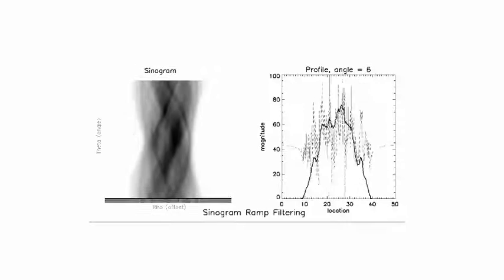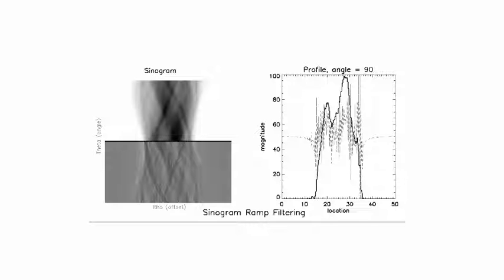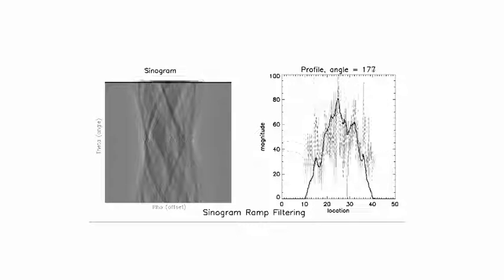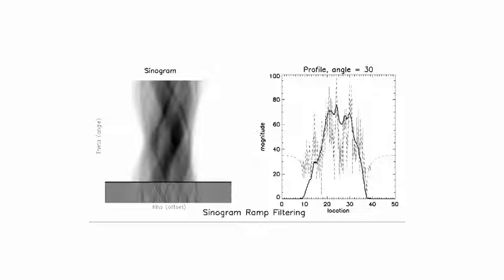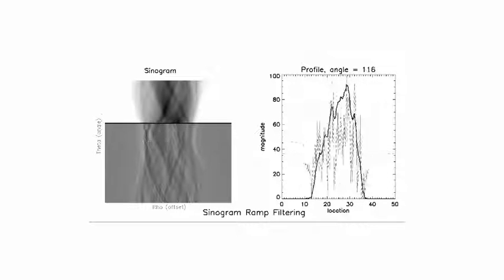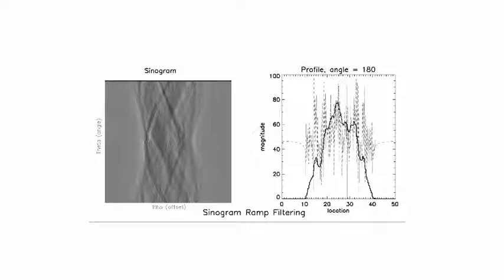In the inverse Radon transform, the beams pass parallel one to another. I mean, it's a straight beam. It does not deviate or form a triangle shape. That's the fan way. The beams are all directed to a single target, in a triangle or fan shape. The inverse Radon transform is a little more efficient, and CT of latest generations use this, mostly because of efficiency.